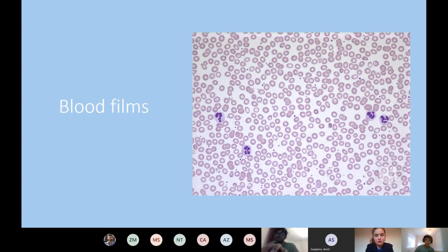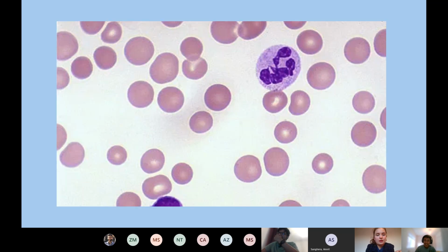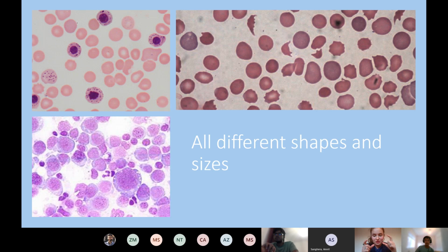There are the neutrophils, which are the hypersegmented purple guys. And then I had one that was, this one's iron deficiency, so it's pale. They're smaller cells, they're all different shapes. And then these are the large cells, which I can probably convince you of, compared to the neutrophil, they're a bit big.